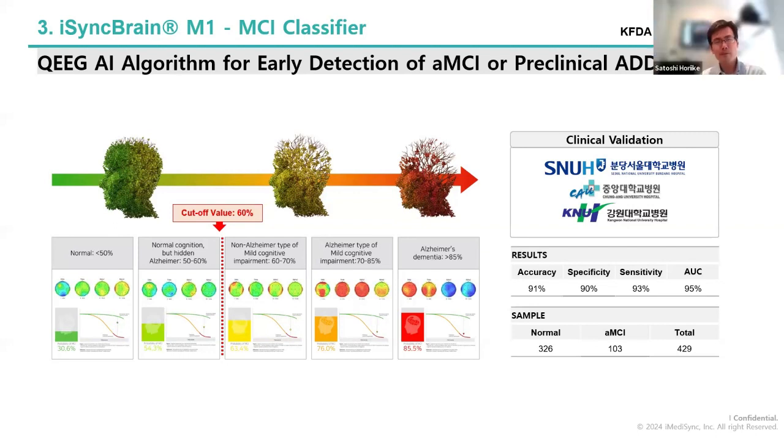It must be very helpful. Yeah, that's the new trend of the AI world. But the current model does not give the specific cause of that number. It is very difficult to associate which kind of pattern makes this probability.